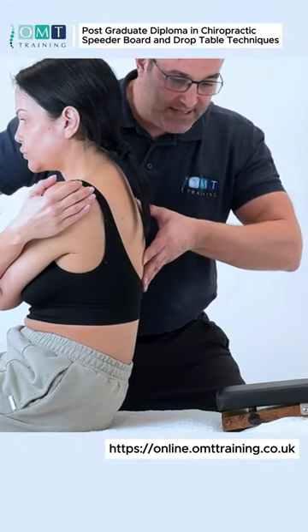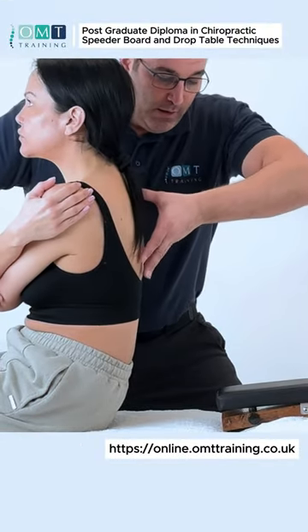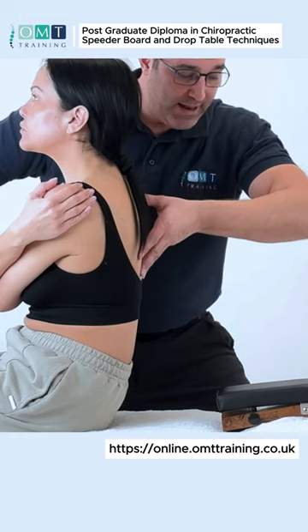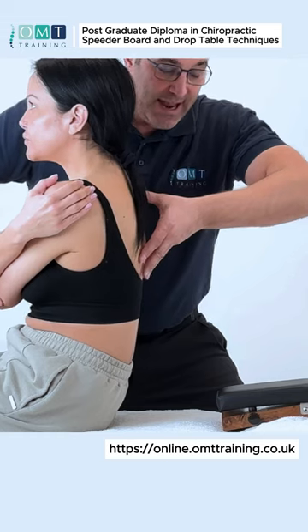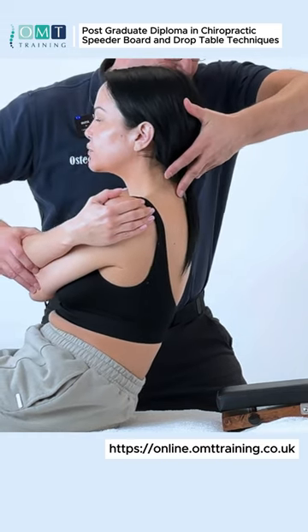The patient has their arms crossed into that V section, and I'm controlling from the front and the back. I have one hand on the elbows, the other hand on the thoracic area. As she rolls down, you may want to support the head.